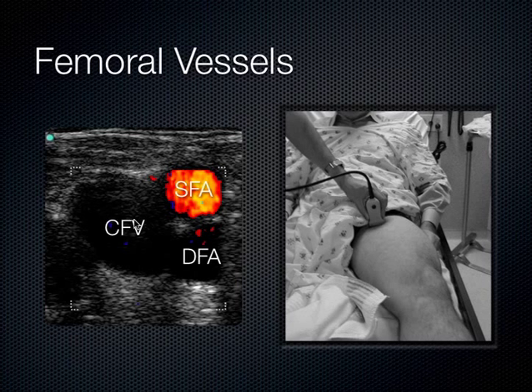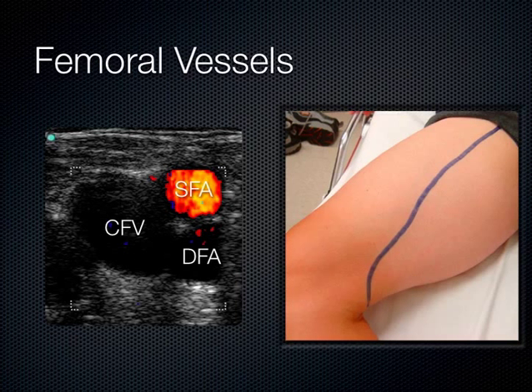Left leg, very good. The way I remember that is venous is closest to the penis. Venous penis is how I remember the medial-lateral configuration of the femoral vasculature. And we know that the femoral vein courses its way down the leg, and this area right here, it goes into the superficial femoral canal, or adductor canal, where it's very difficult to insonate, but then eventually comes in the popliteal area where it gets easy to see again.